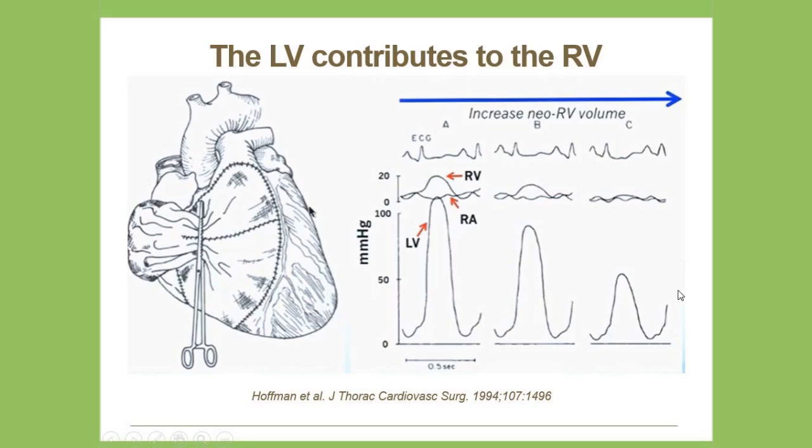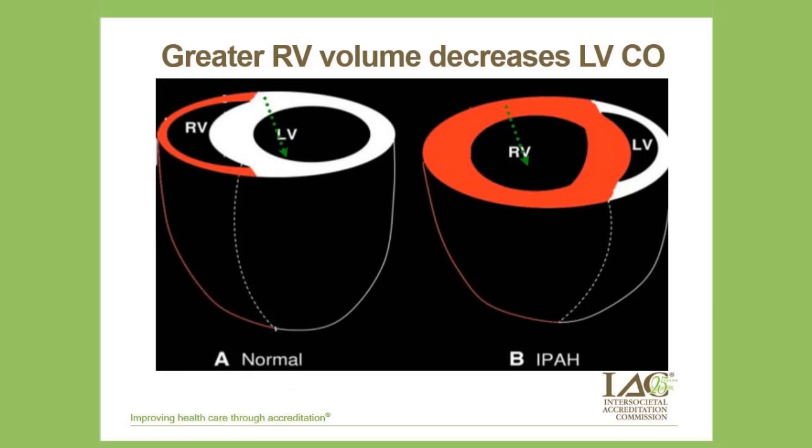What can explain this phenomenon well is by this cartoon that I found on the web. Now, on the left of the screen is a normal RV diagram. As the right ventricle progressively gets loaded with volume, what happens is the pericardium prevents it from expanding more. As a result, with continued volume loading, the right ventricle would have developed high enough pressure to push the interventricular septum towards the LV, decreasing the LV size, thereby decreasing the LV stroke volume.